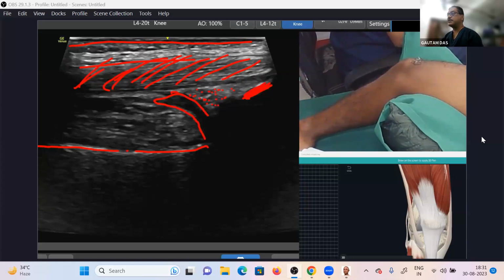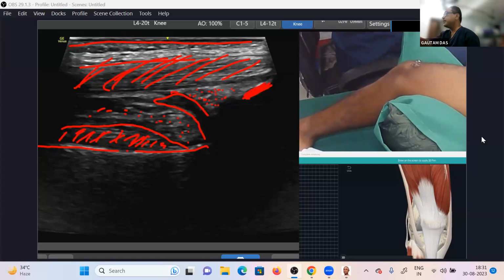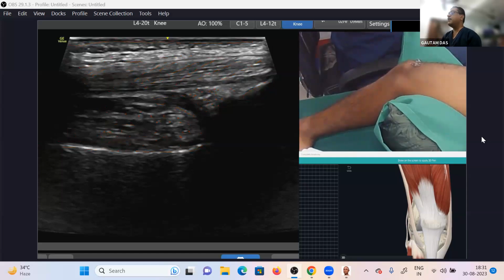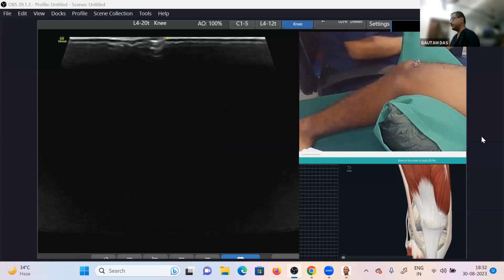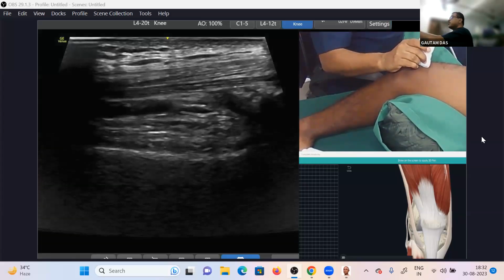So it is an extension. It is not a bursa basically. It's an extension of the suprapatellar synovial recess. After that, there is one layer of muscles, and this is another fat pad. This fat pad is the prefemoral fat pad. This is your articularis genu muscle. Okay? So fix it in your mind, the home page. What are the structures? Is everybody able to understand? I'm showing you again. Let me decrease the depth a little bit so that you can appreciate it better.